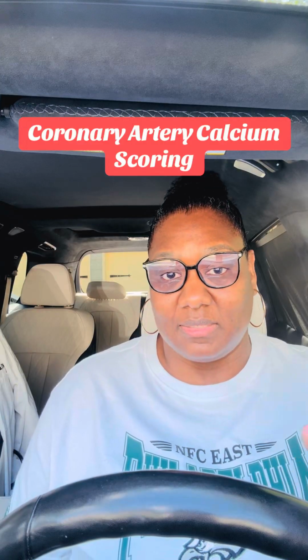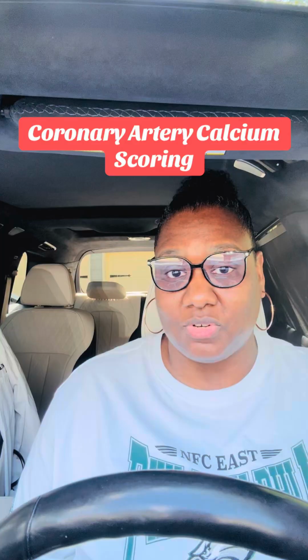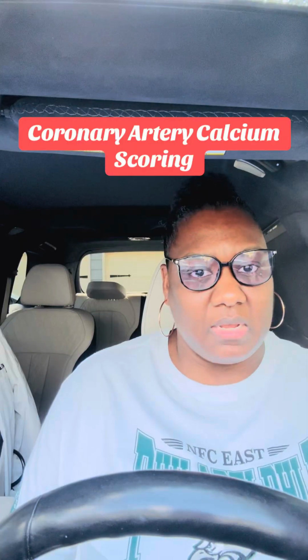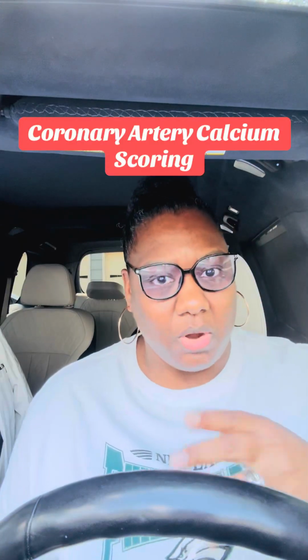The nitroglycerin doesn't last in circulation very long, so an hour before you will get that beta blocker, and then right as the technician is ready to take your images, they'll have you pop the nitroglycerin under the tongue, and then the pictures from the CAT scan will be taken. The test in its entirety will probably last anywhere between 30 to 35 minutes or so, okay?